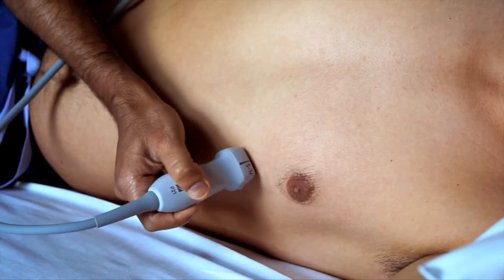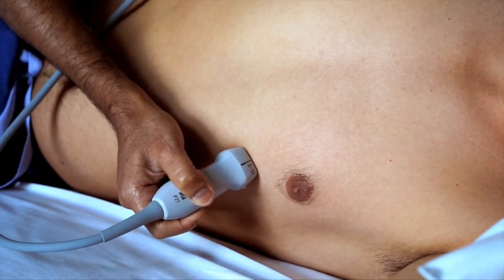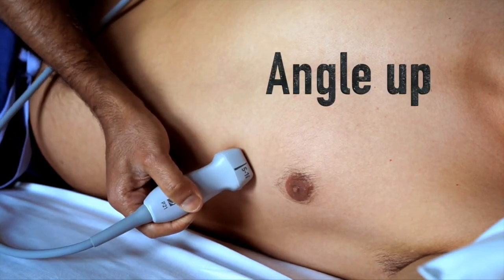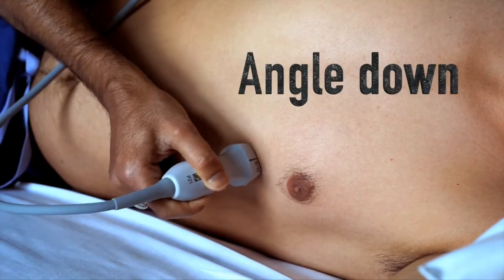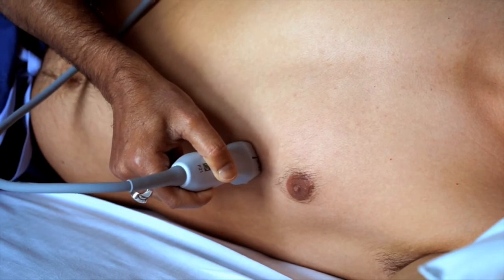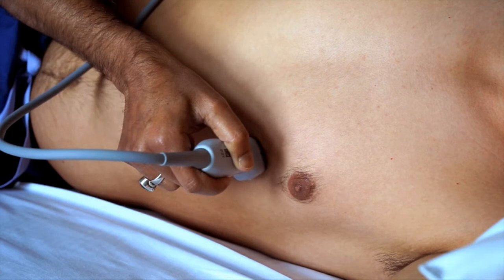Now you can see here the various maneuvers of the probe and the different nomenclature used. So first of all, angle up. Somebody may tell you this is tail down, or angle down, which can be also said as tail up. Now this is in regard to the coronal plane of the human body.